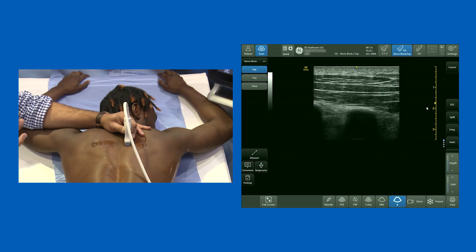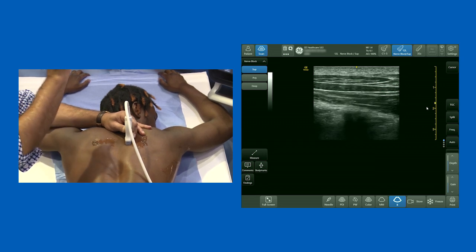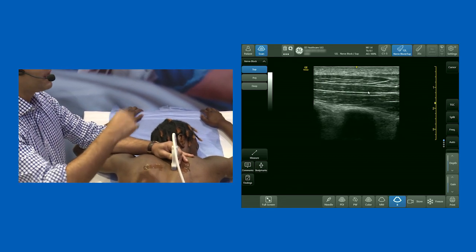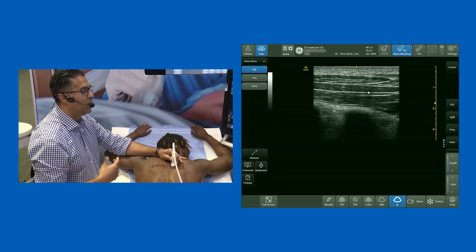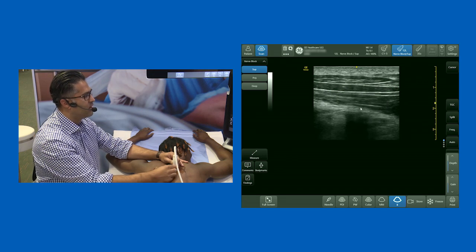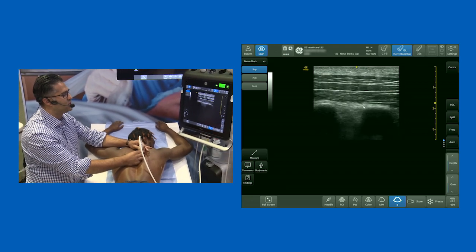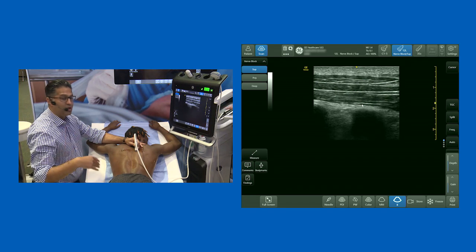Now with this view we've got the perfect plane to do the erector spinae plane block. When Ferrero and colleagues including Kijin initially described it, their first approach was to inject local anesthetic above the erector spinae muscle. In their subsequent modification, they changed the injection technique by injecting below the erector spinae muscle — right at the level of the transverse process — aiming to inject local anesthetic just above the fascia there.